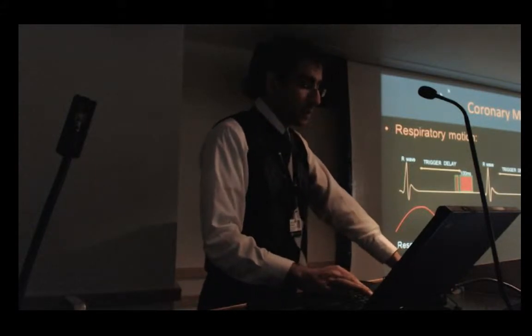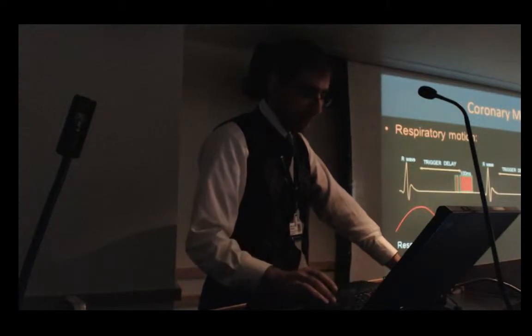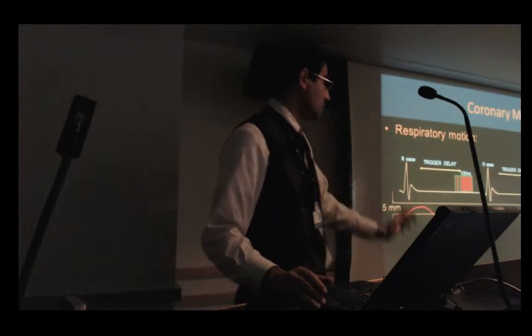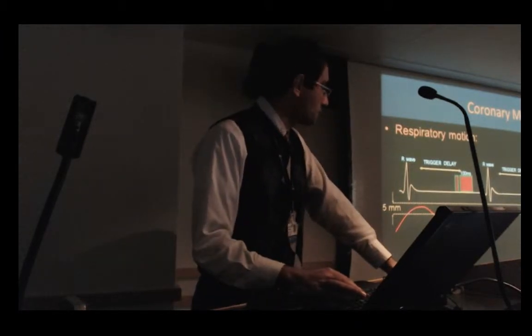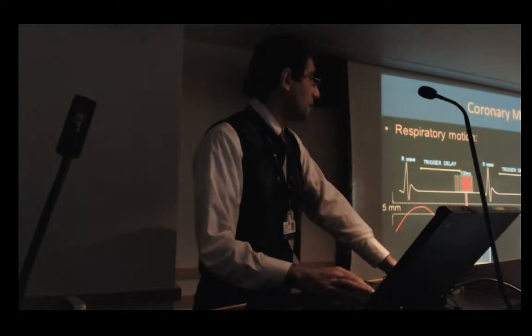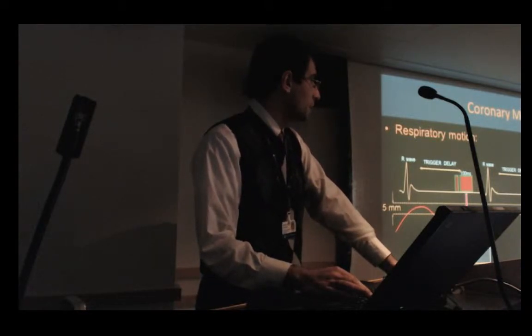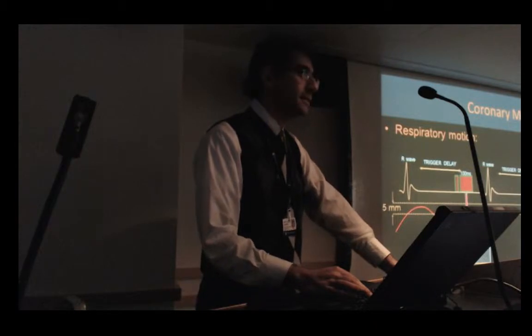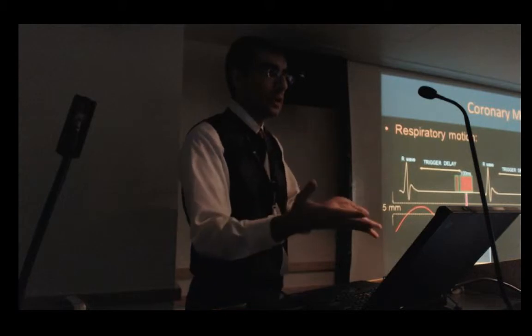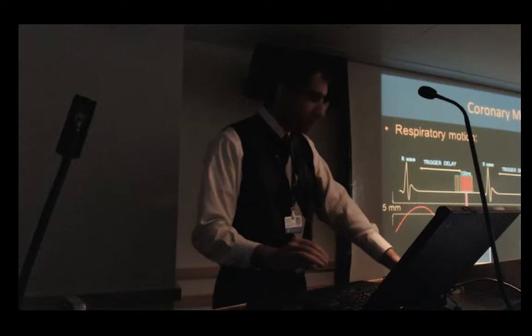So we have the two-dimensional pencil beam navigator to track the respiratory motion. And then we usually put a very narrow gating window of 5 millimeters to suppress the respiratory motion around end expiration. End expiration is the time that the heart is at the highest position. So we detect that, and then we set up our gating window of 5 millimeters around end expiration, and we monitor our acquisition data. If my 20 k-space lines are acquired outside the gating window, or at the beginning of the inspiration here, we are going to reject the data because they are corrupted by the respiratory motion. They have not been acquired at the right place.